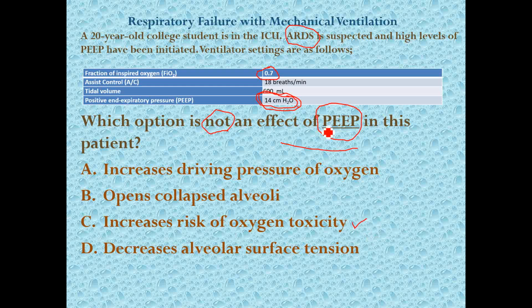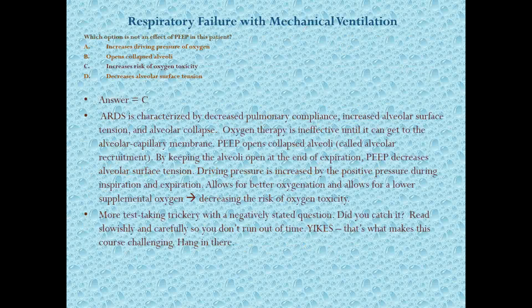Because here's what happens. If you have a patient that's on very high O2, we know that O2 has the potential to be toxic. Well, we can bring down the supplemental O2 by increasing the PEEP, because supplemental O2 and PEEP, positive end expiratory pressure, both help with oxygenation.